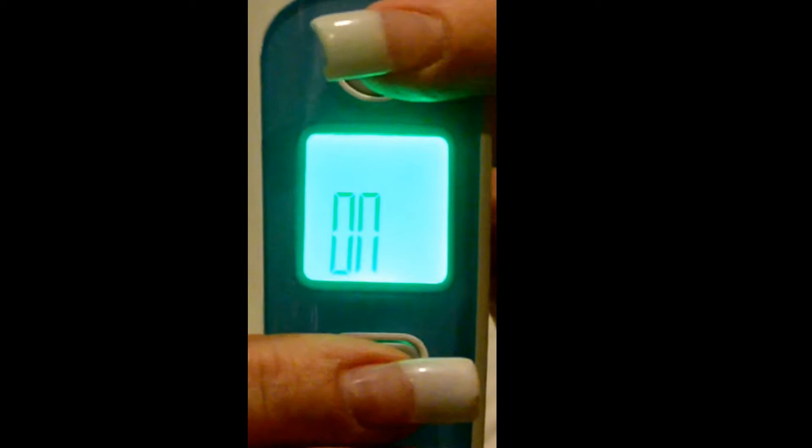Then what you want to do is press this button here and it will change from Celsius to Fahrenheit. Press this button again and it will take you to the sound setting — it says 'on'. If you want to turn the sound off, press this button here and it goes to 'off'. Press it back on and it will go to 'on'.